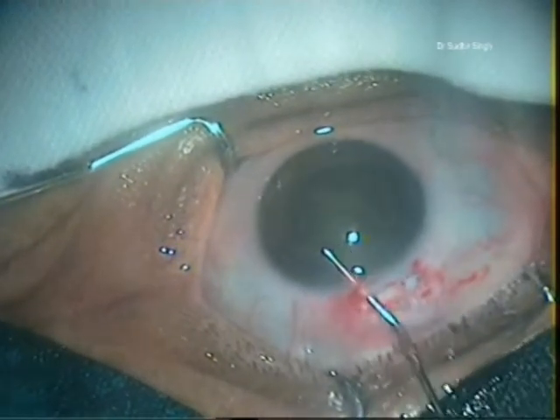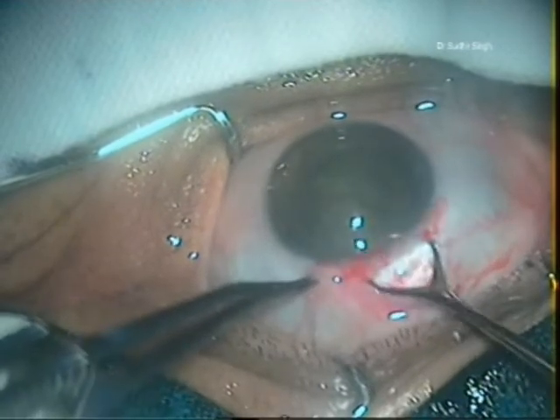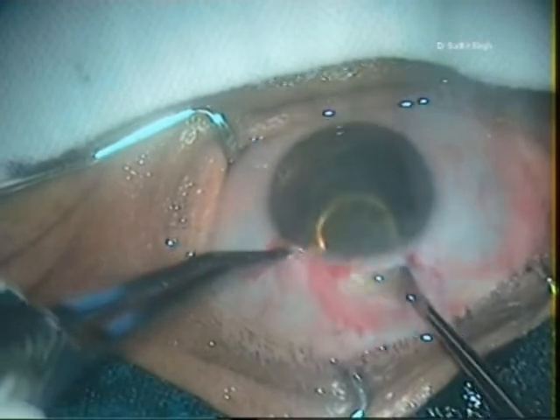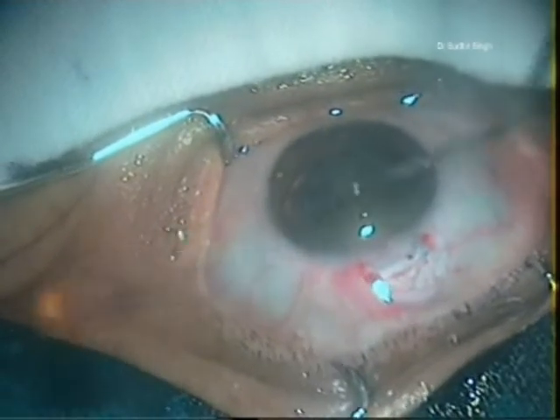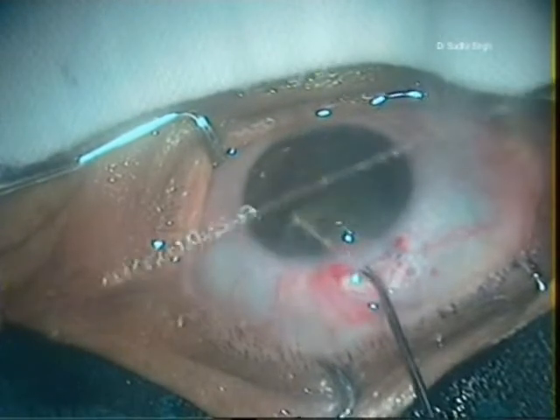The nucleus is engaged in the lens loop and slowly withdrawn from the anterior chamber while the posterior lip of the tunnel is depressed. Once the nucleus gets engaged in the tunnel, the vectis is pulled posteriorly and upwards. This causes breaking and removal of a part of the nucleus, and the other part remains engaged in the tunnel.